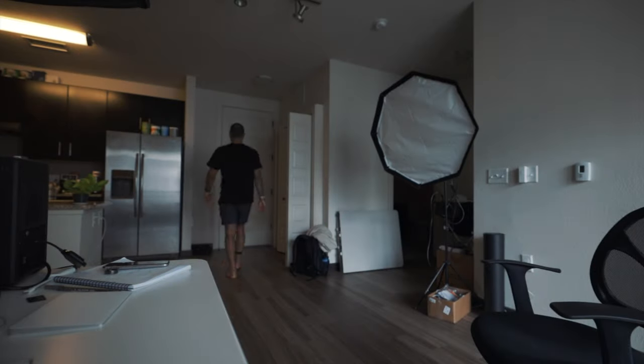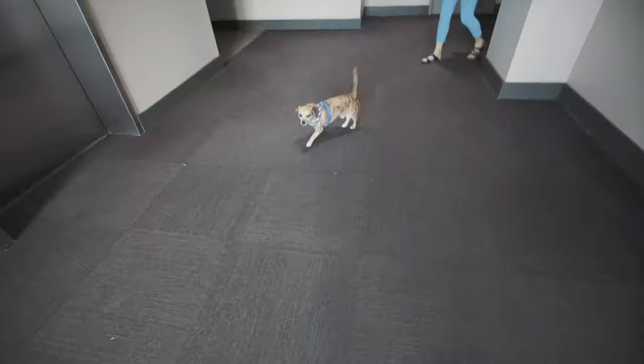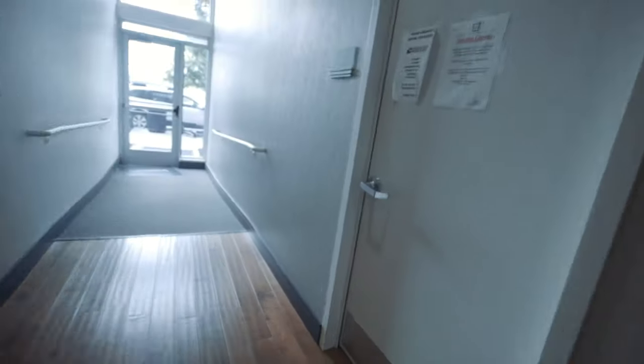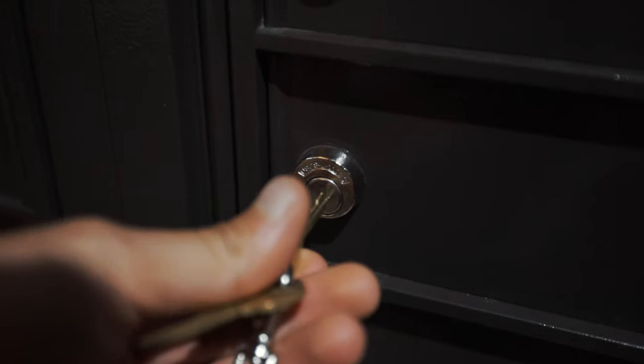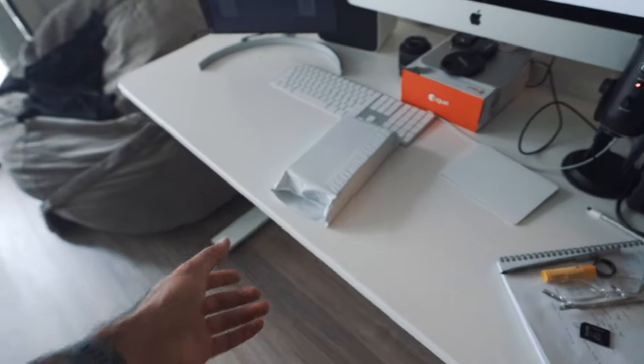A package has arrived. Let's get it. Welcome to the unboxing of the Nokia Thermo.